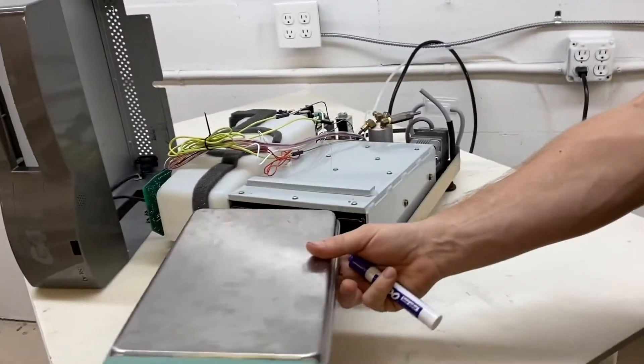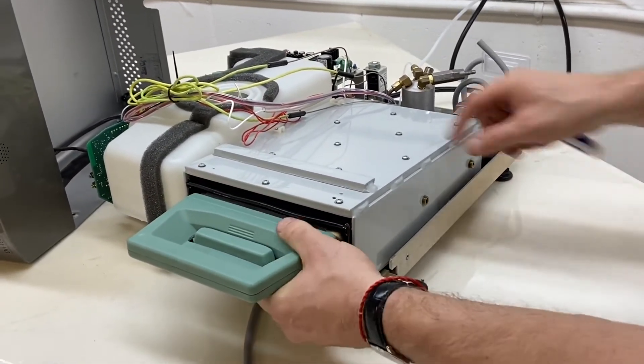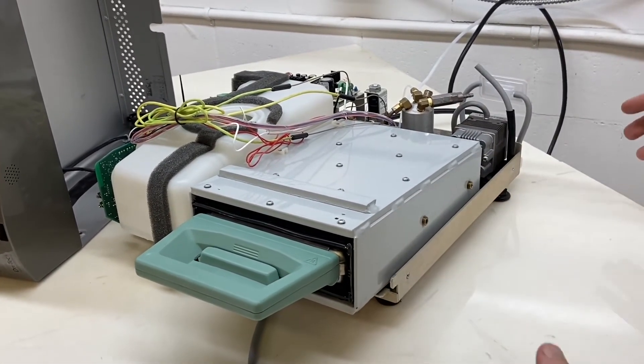Then we are going to go to the solenoid. Power your unit on, insert your cassette — it should click. If there's anything stuck in it, it's not going to click. So if you need any help with that, give us a call.